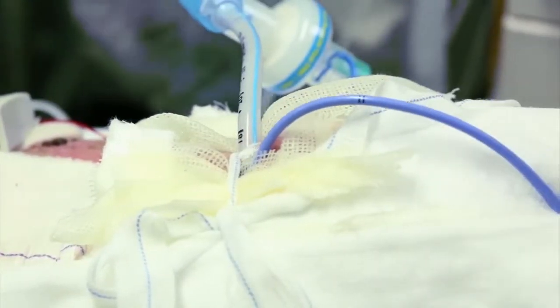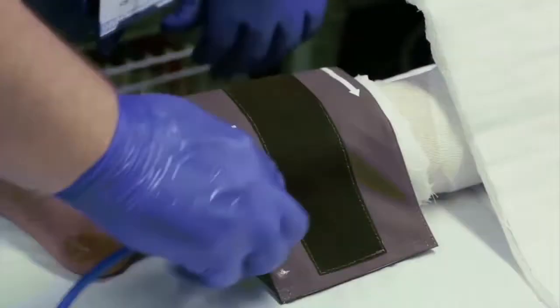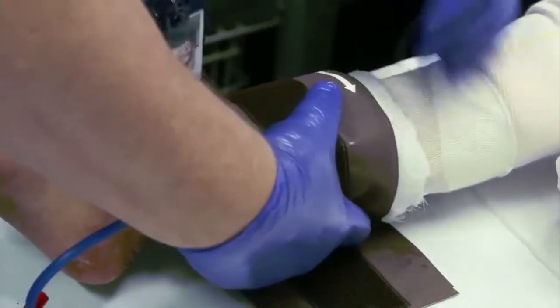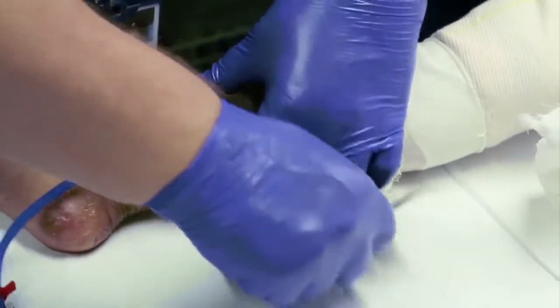Non-invasive or intra-arterial blood pressure monitoring can be used depending on need. Here we see the non-invasive cuff being placed over a dressing lined with Gelinet gauze. Here, a dressing is removed using Niltac spray to avoid skin damage.